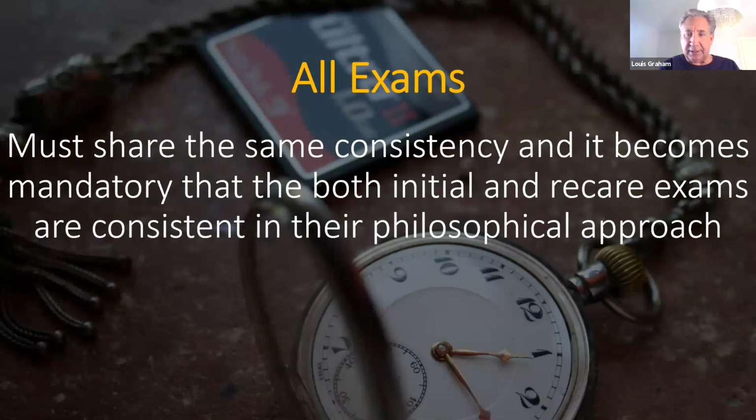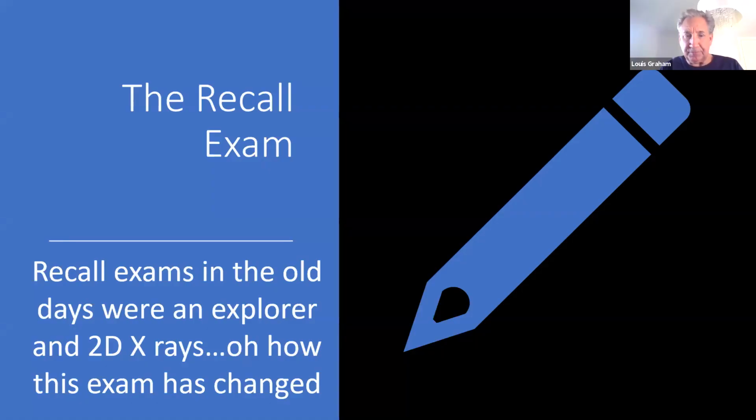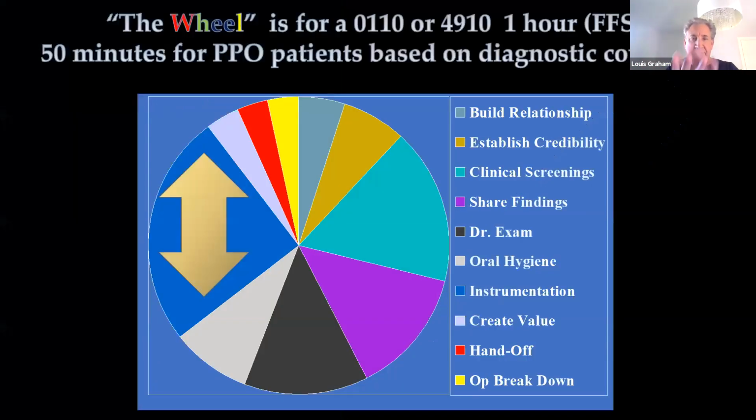Whether it's my initial exam or a recare exam, which I'm going to start with, you have to have the same philosophical approach. So in our office, recall exams are not the old days with a hygienist taking an explorer and picking away into fissures and getting false readings. It's totally changed. So this is my wheel.